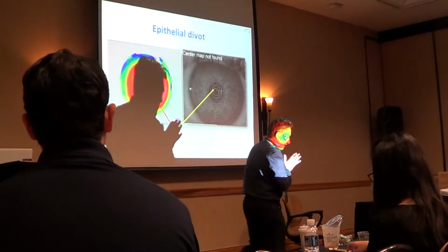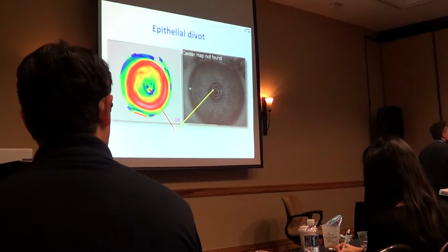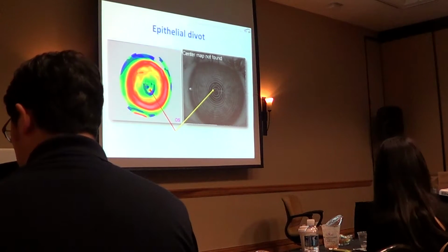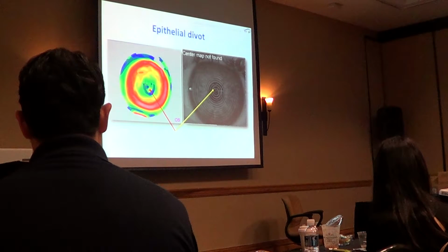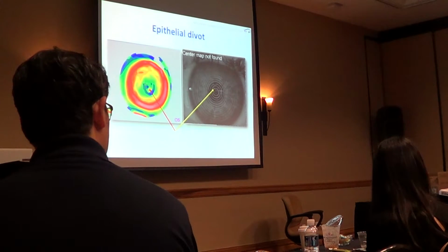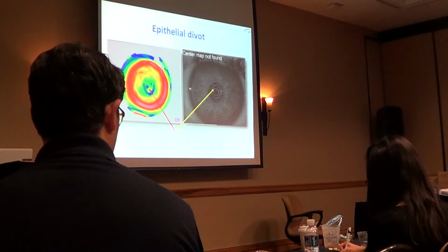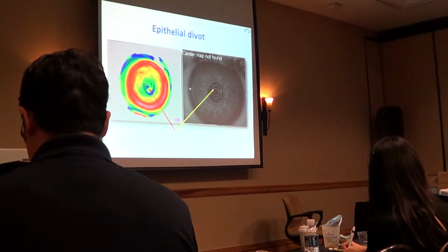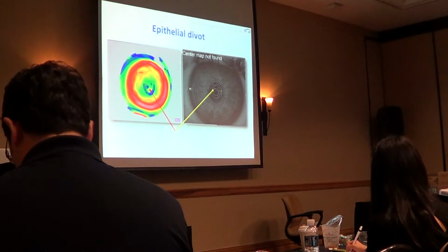Oh yes. The easy way is to change everything. The easy way, in order not to feel so much, you change every curve by a quarter diopter. That's the easy way. That is 14 microns. The not so easy way, you change every small piece of the lens to obtain what you want.